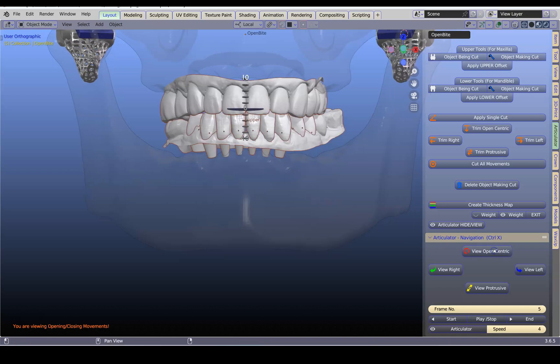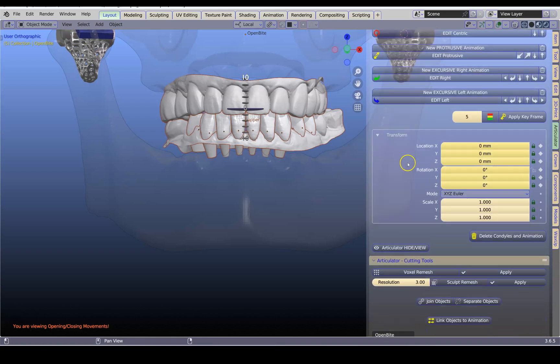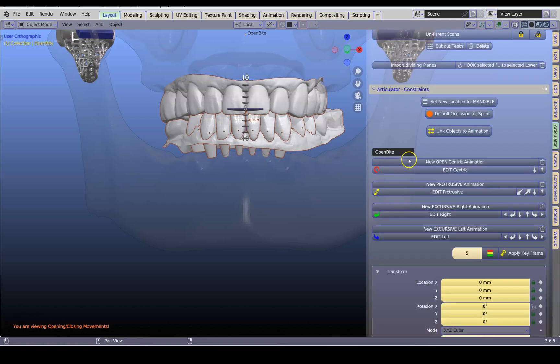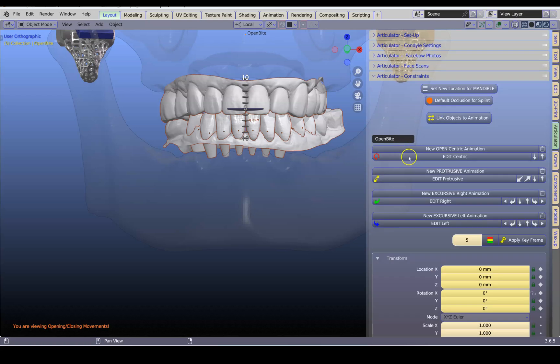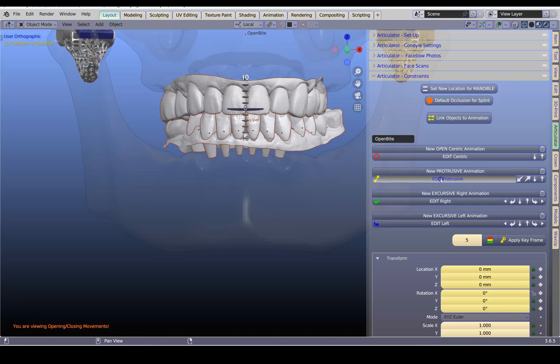So next step is we want to adjust this. Go back to the open and then go to the Constraints. To close these folders just hover over the top bar, hold down the Control key on the keyboard and left-click — this will close it all down. Now that they've been linked up we can reset these. First of all I'm going to go to Edit Protrusive.